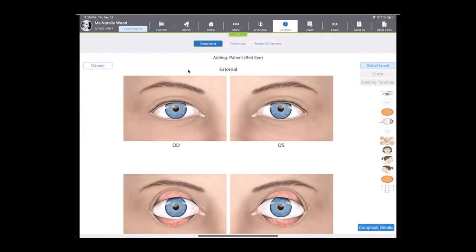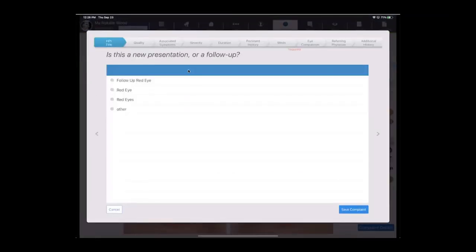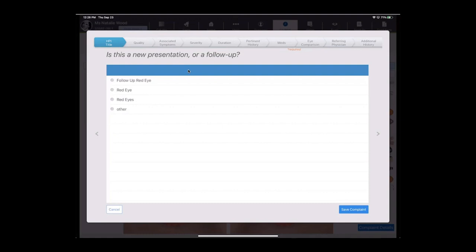I'm going to tap on patient red eye, and then I'm going to tell the system where it's located. Today, we'll say that it's in both eyes, so I'm going to tap on the right and the left eye, and then go to my complaint details. The system's going to ask me a few questions to build a really nice formal chief complaint. I don't have to answer all of them, but the more you answer, the more comprehensive that complaint will be.